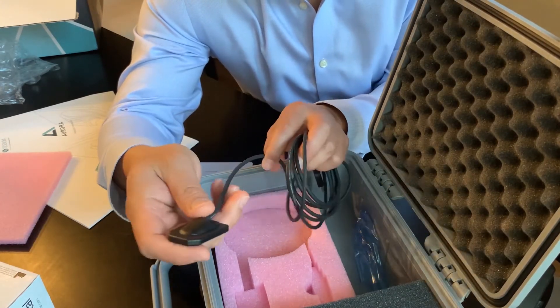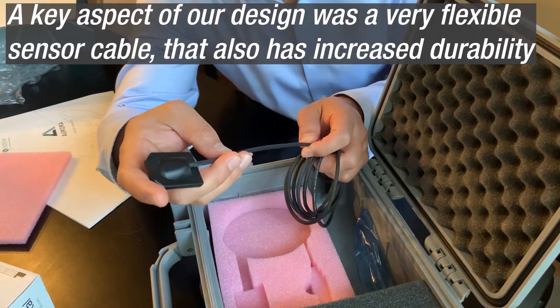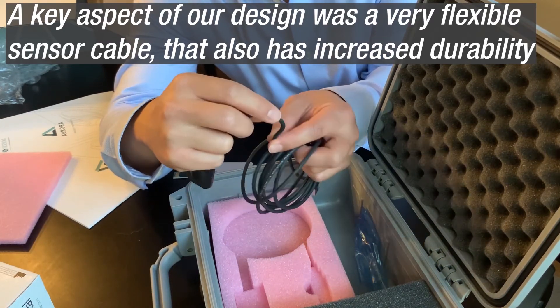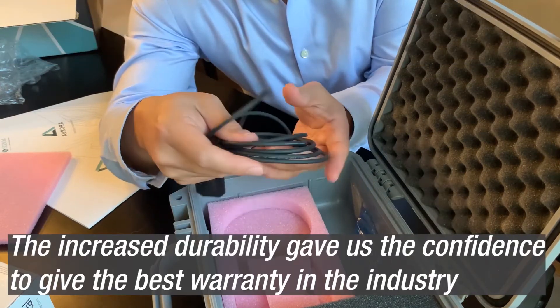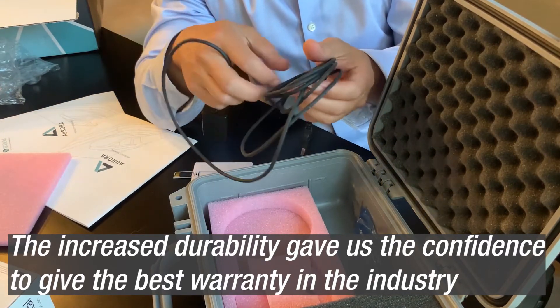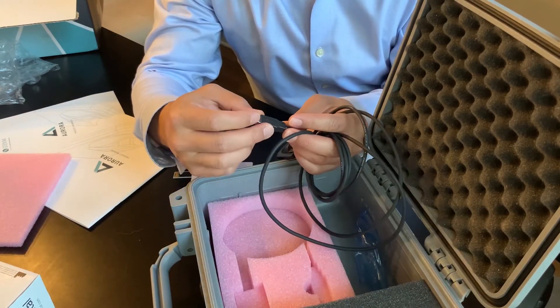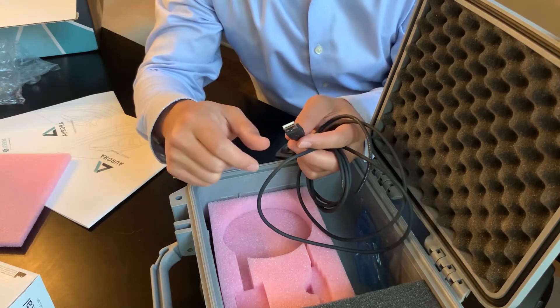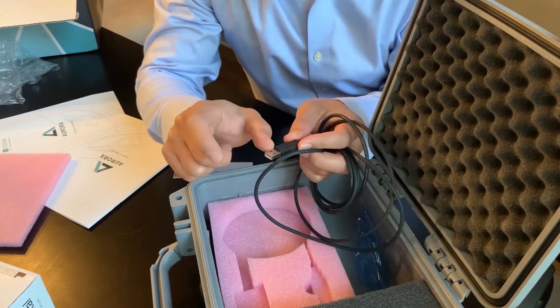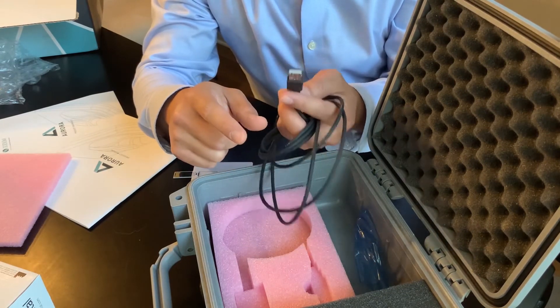This cord is pretty thick. Some of my Apple knockoff cables are thin, but this is pretty durable — it's harder to get a kink and there's more protection against damage. There's a pretty long, standard length cord. One recommendation: use a very short USB extender in your office, because one of the parts that commonly fails is the cord or the USB hub. You should use a powered USB hub — meaning the hub has its own separate power source — and use a USB extender to protect the longevity of the sensor and reduce the risk of it being sent off for repair.